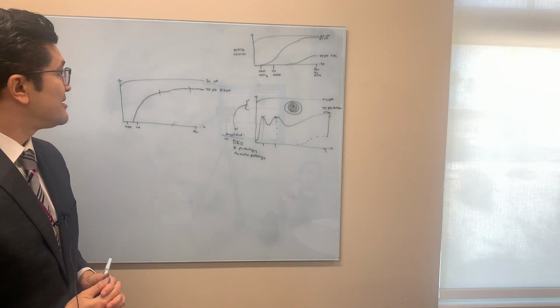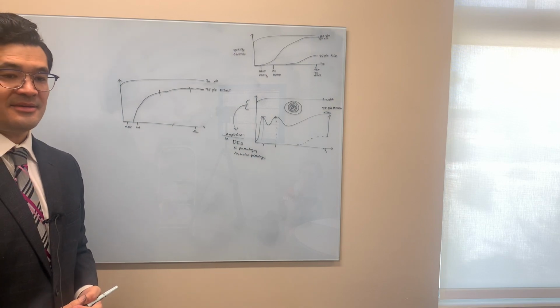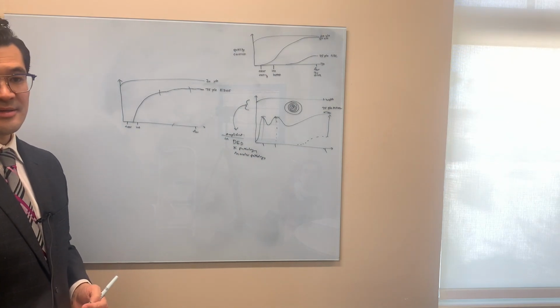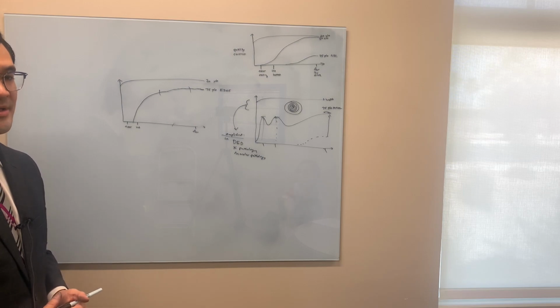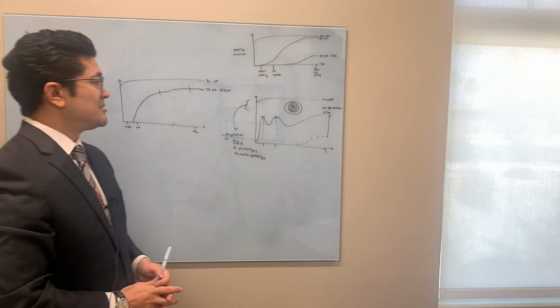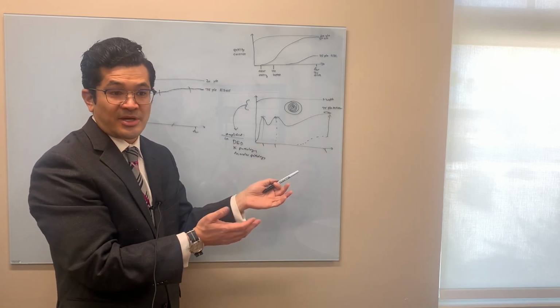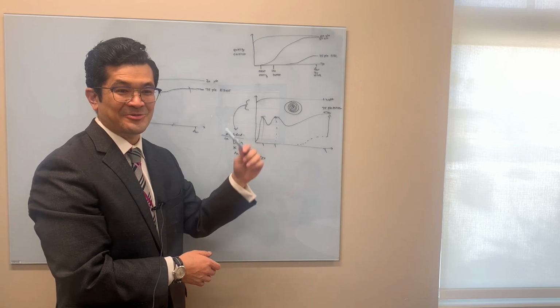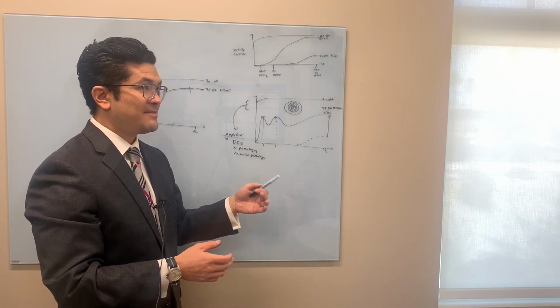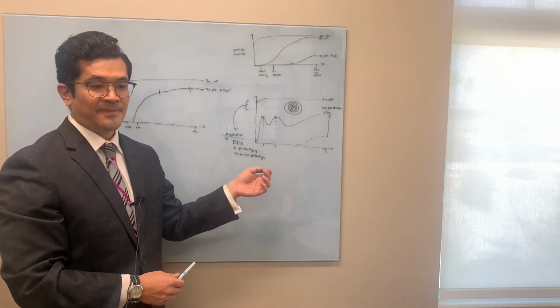And for the Panoptics, to which patients would you confidently advise Panoptics? Because the younger ones, obviously, they're going to make sacrifices with quality of vision, and the older ones, the 75-year-olds, they often have AMD and things like that. Well, for anyone that's considering a multifocal, whether they're 50, which we've done, it's okay, 40 even. We had a 42-year-old three months ago. He went with Panoptics. You want to really make sure they understand the nuances and the trade-offs involved with this.